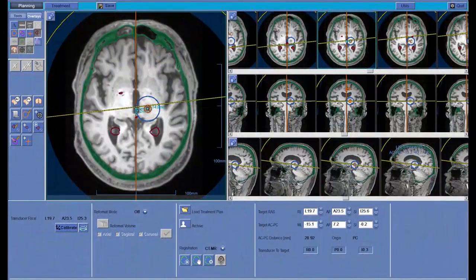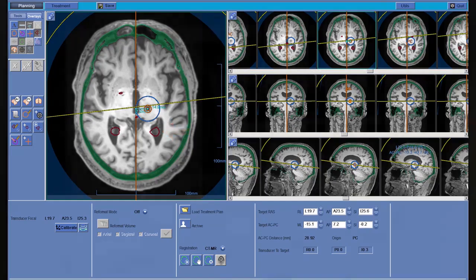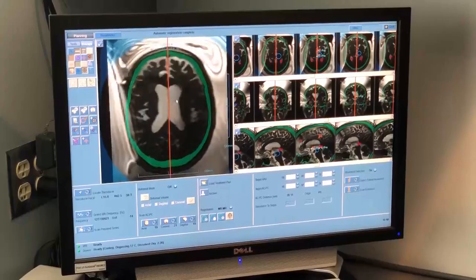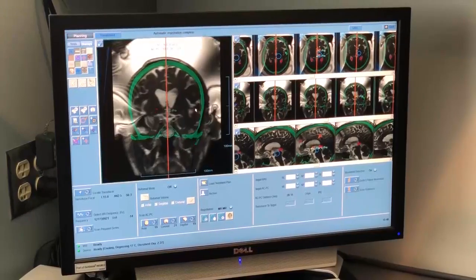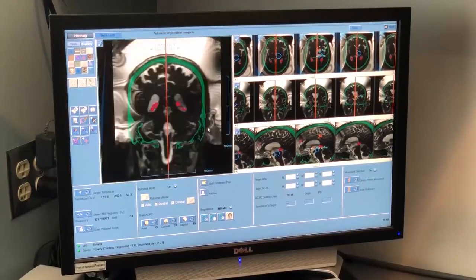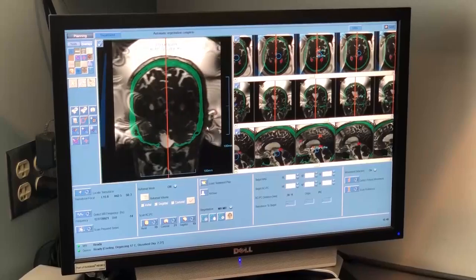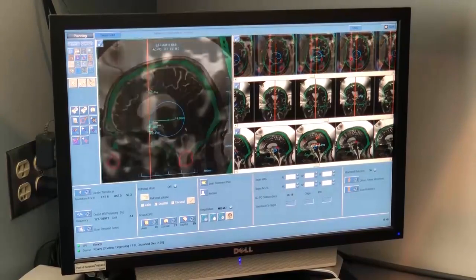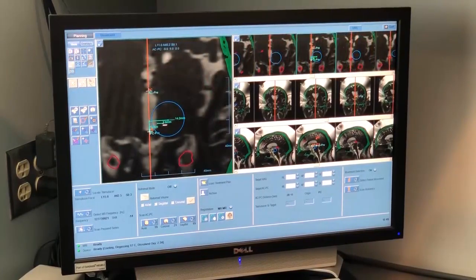Preoperatively obtained volumetric CT and MRI scans are fused and used for planning. No-pass regions like aerated sinuses and intracranial calcifications are marked so that ultrasound will not be delivered through these areas. Localizer MR images are then acquired either in all 3 planes in relation to the intercommissural line or as a 3D scan that is later reformatted in all 3 planes. These reference images are fused to the preoperative CT scan and higher resolution MRI. Stereotactic planning can now be performed.